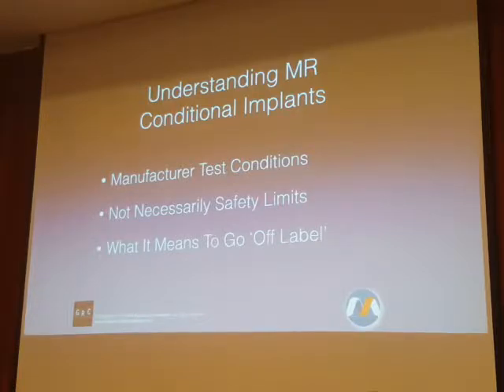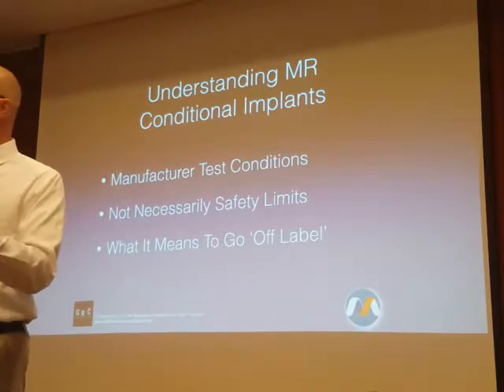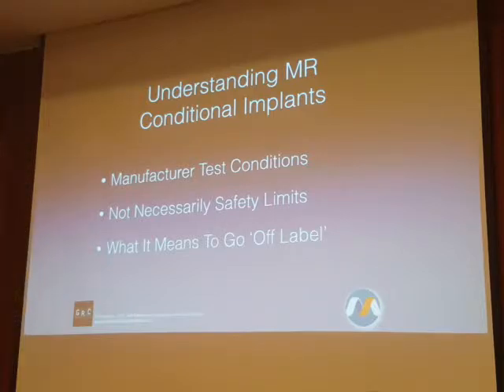So now I can go to the FDA with my testing information, and I can say, I tested this at 0.3 Tesla. I ran pulse sequences at 0.1 watts per kilogram, and none of the safety parameters were exceeded. And the FDA is duty-bound to say, if you tested it and it didn't exceed the safety thresholds, we will approve MR conditional labeling for this device. Again, it doesn't matter that it was tested under conditions that nobody in the real world is actually going to experience. They can get an MR conditional label based on that.